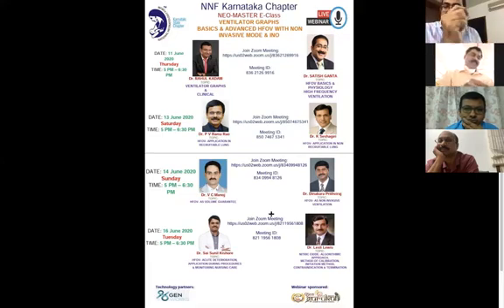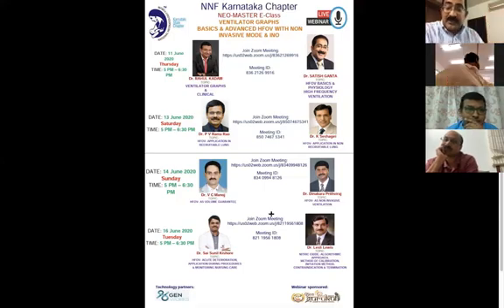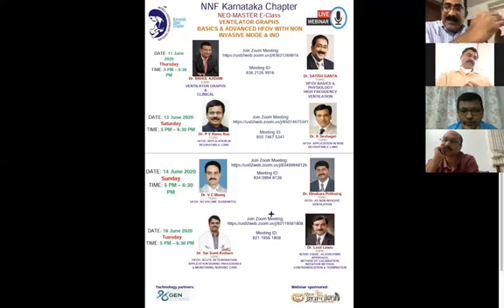What is important is you need to sit with the baby. Okay. Many a times the residents keep asking me, sir, I put the baby on the oscillator, can I go elsewhere? No, you have to sit with the baby. As soon as you put this child on the oscillator, until you get the blood gas, the first 40-45 minutes, your recruitment needs to happen. So once you put the child on the ventilator, you recruit your lung well by all the recruitment maneuvers.